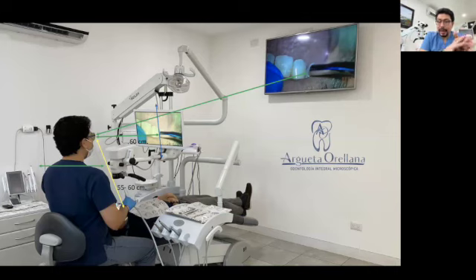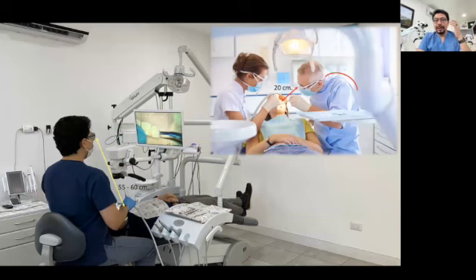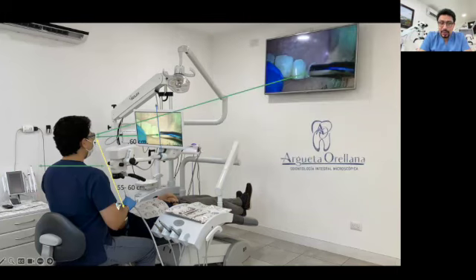Another important factor, your vision should go straight to the center of the screen. So your vision should hit the center of the screen at a 90 degrees angle, for having the sharpest 3D images. Of course, if you are not looking at the screen at 90 degrees to the center, you're still seeing in 3D. But there is a small difference that can represent a problem if you are working removing a broken file, for example.